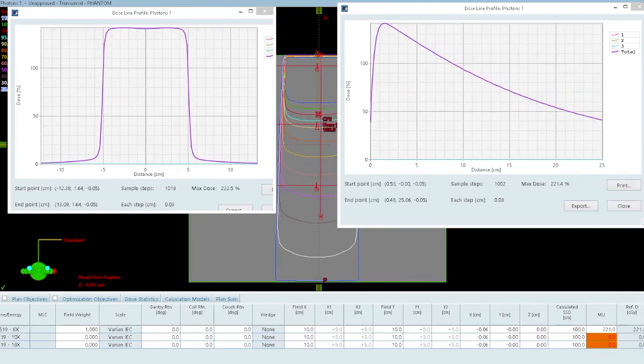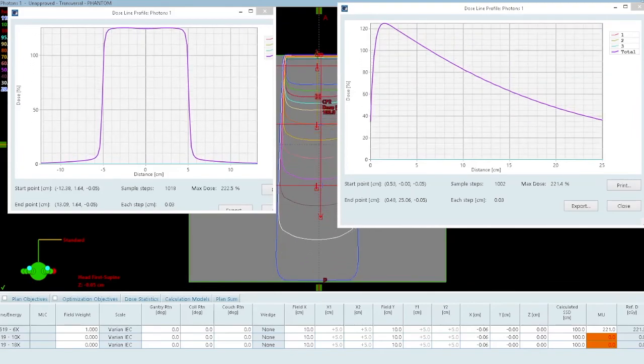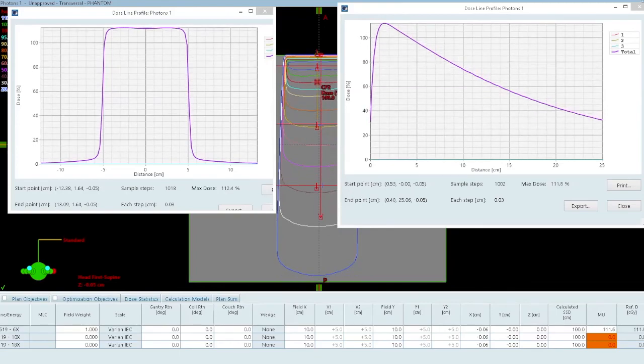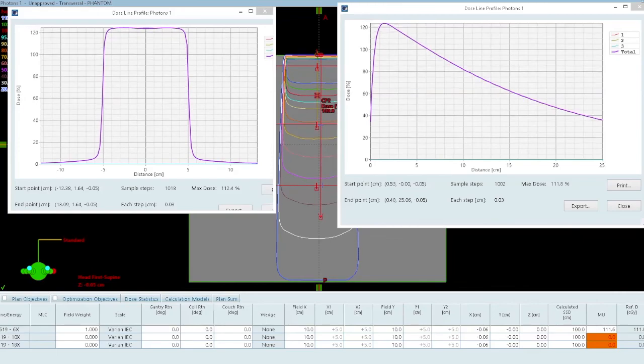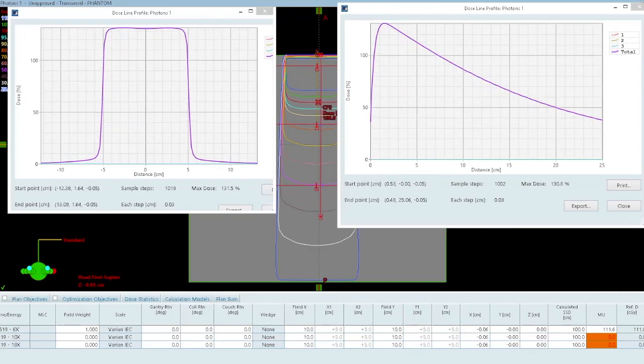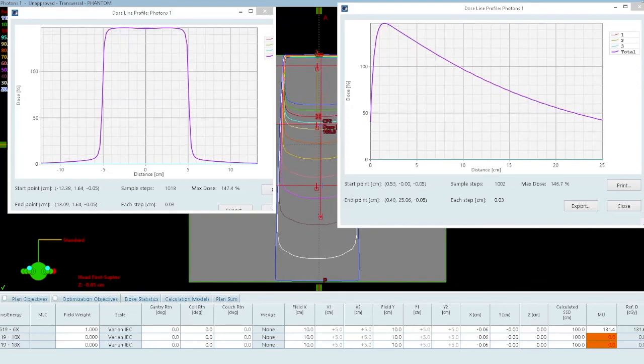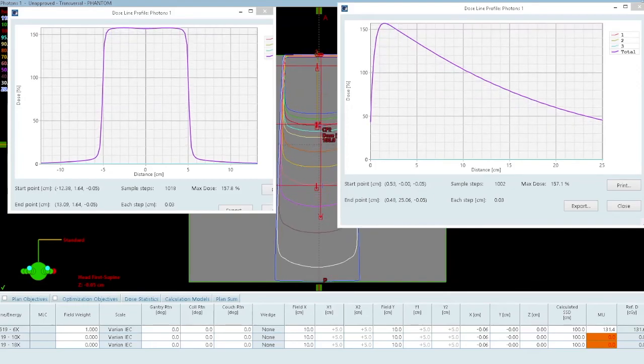So when we do a clinical treatment plan, we're not just calculating to D max. Sometimes we may with electron treatments, but the majority of the time we're normalizing to either a point or we're normalizing to get some sort of percentage coverage of your target volume, like your PTV.